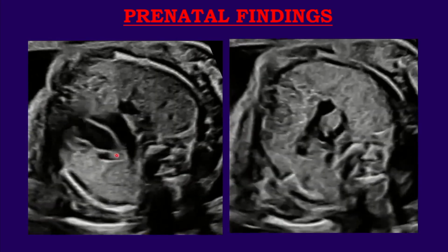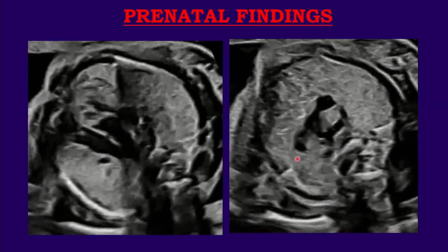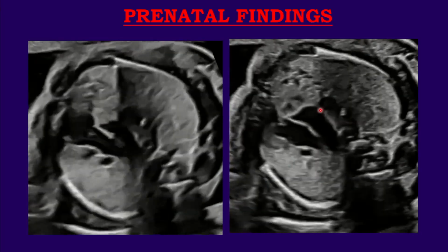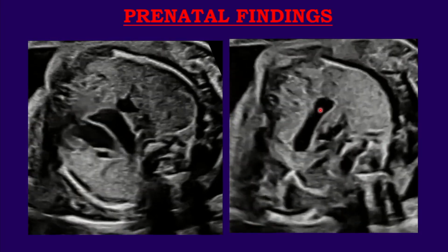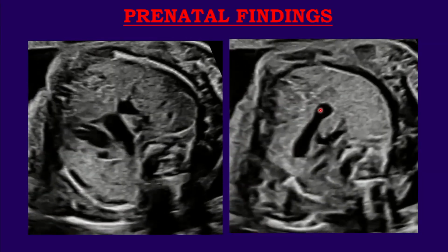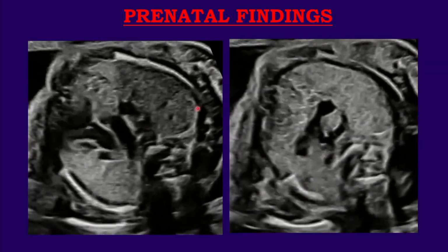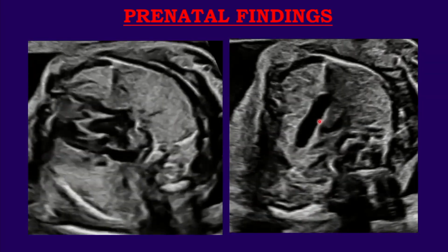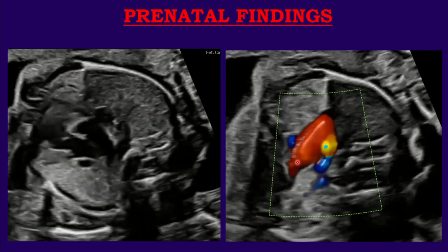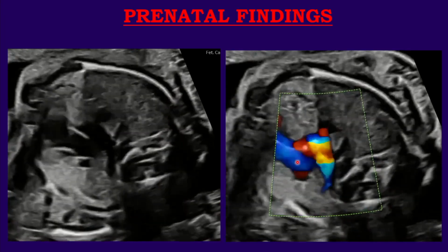Or at least the same image that we can see on the right. But going further up to the upper mediastinum, we also can visualize the thymus, and we can see the posterior border of the thymus, which is the brachiocephalic vein. Based on general knowledge, if you have the persistent LSVC and if you interpret this vessel as persistent LSVC, you should not be able to see the brachiocephalic vein. It's usually absent. So we will add color on, and we can see that the brachiocephalic vein is not absent, it's there, and it's dilated, and it shows significant blood flow.